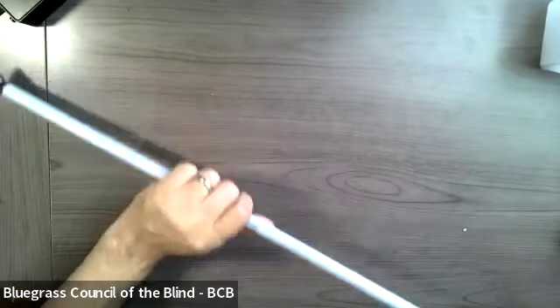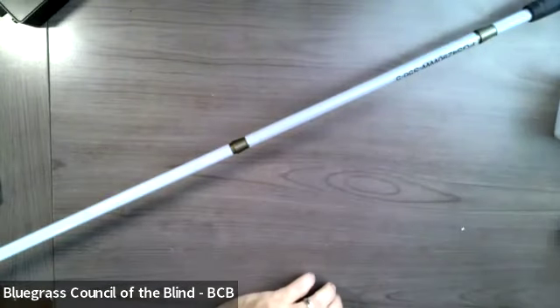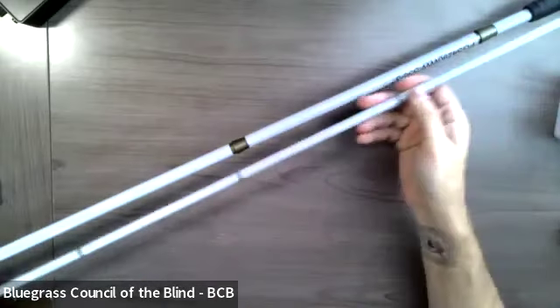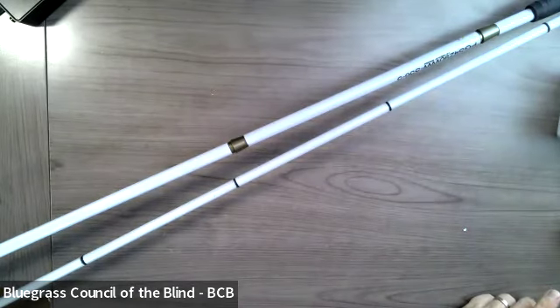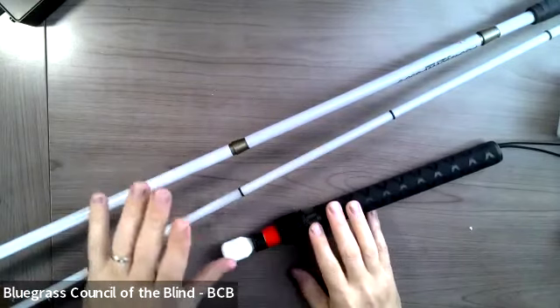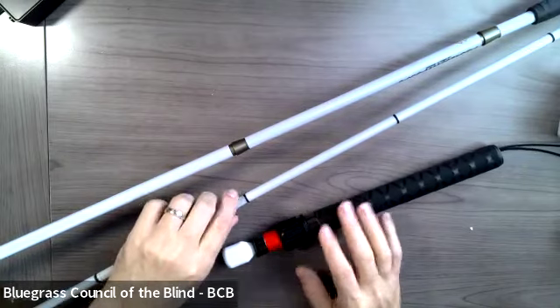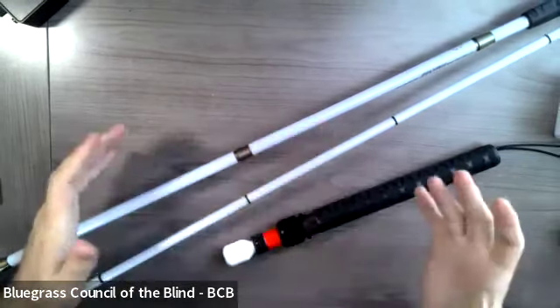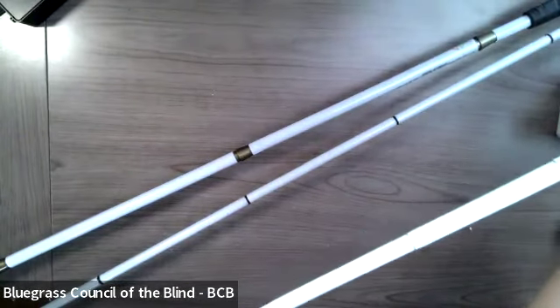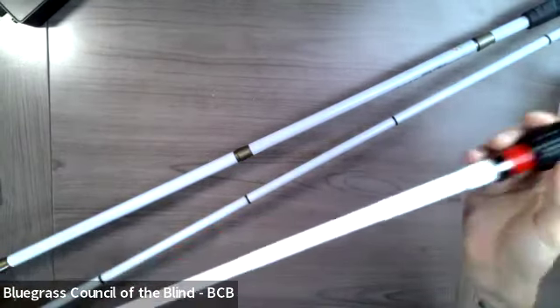So this is a mobility cane. Let me arrange it here so that we can see the difference. Then here we have an identification cane. And then here we have a telescopic cane. So it's not as easy to see on the camera, but in real life, it's much easier to tell. The identification cane is much thinner than the mobility cane. It's about the thickness of a pencil, whereas the mobility cane is probably as thick as a magic marker, if that helps people get an idea. And then the telescopic cane is much thicker, but it starts out nice and thick towards the top and then ends up being very small and thin at the bottom because they telescope into each other.